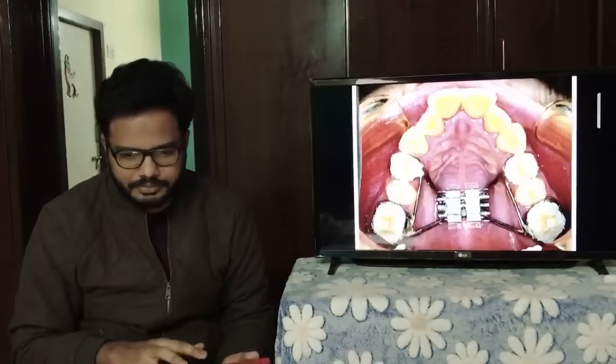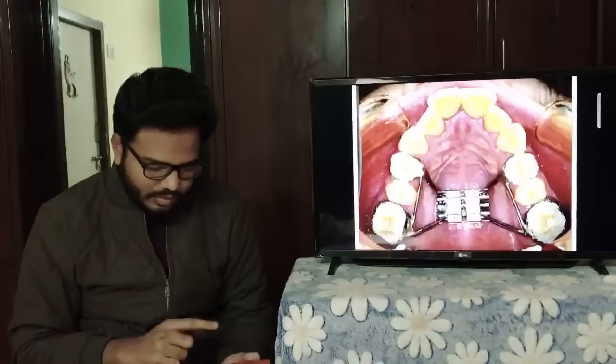Yes, Ramya, I hope you got it right. Hyrax itself means hygienic rapid expander. It's not a slow expansion device. Good. Now let's move on to the next one. Identify the appliance.